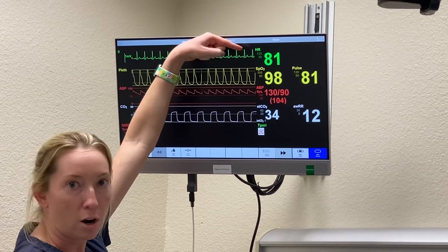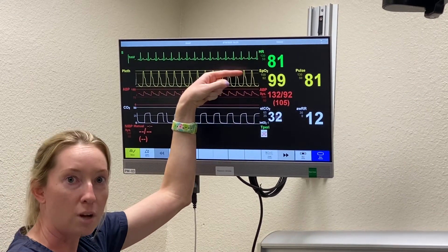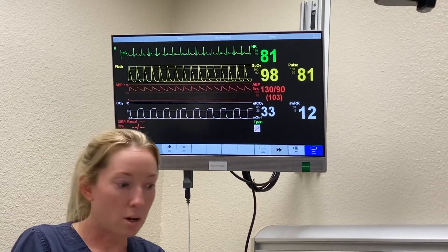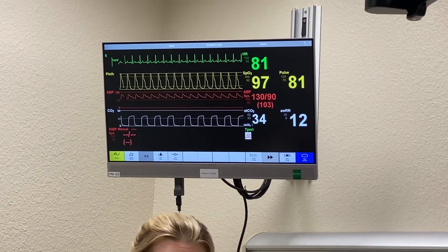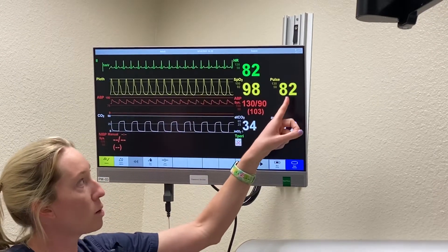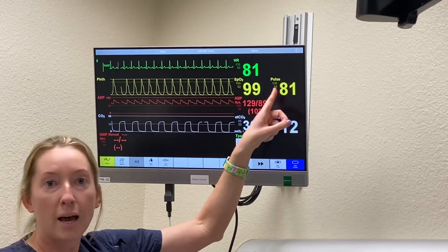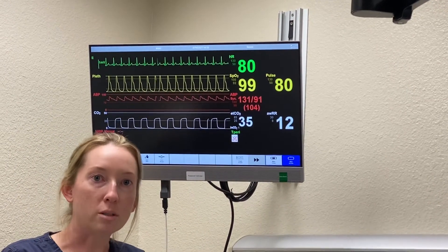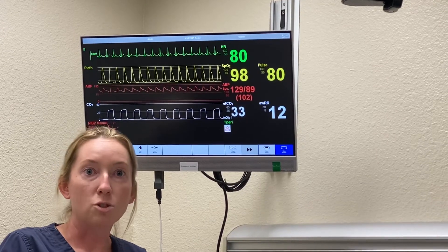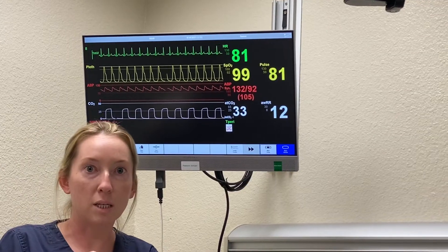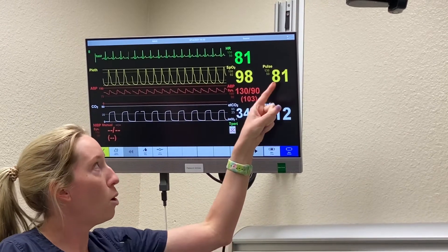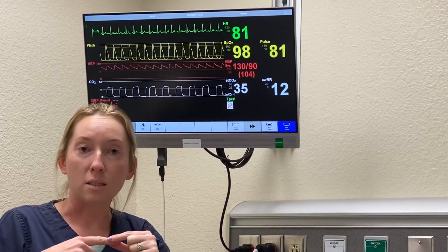Right here we have HR — that stands for heart rate. SpO2 is your pulse ox, coming from the pulse oximeter that you have on someone's finger or ear. Next to that, on this monitor, we're showing pulse — that is the pulse being read from your pulse oximeter, since most pulse oximeters read the oxygen in the blood as well as the pulse rate. Please do not be concerned if the pulse and the heart rate are not perfectly in sync, because these are coming from different locations. The heart rate is coming from your EKG leads, whereas the pulse from the pulse oximeter is being read from wherever that device is currently placed.